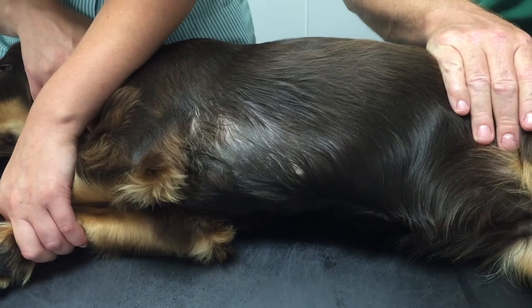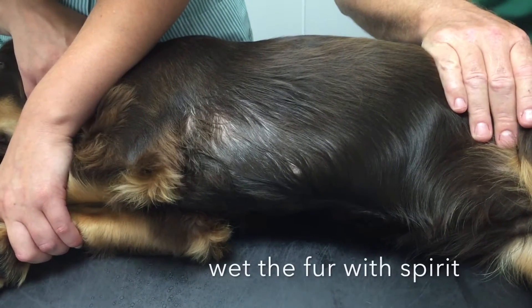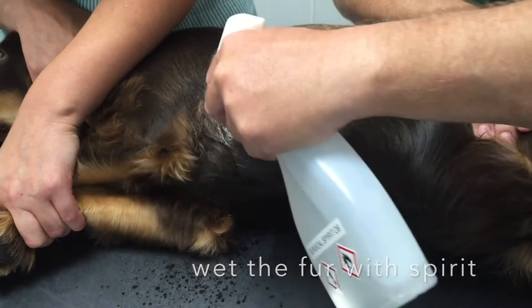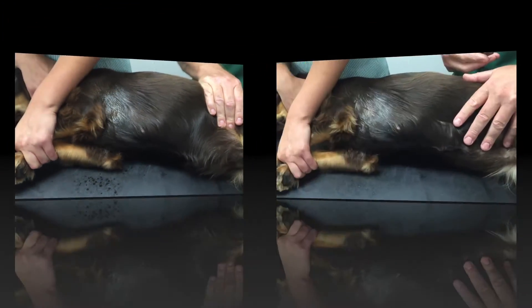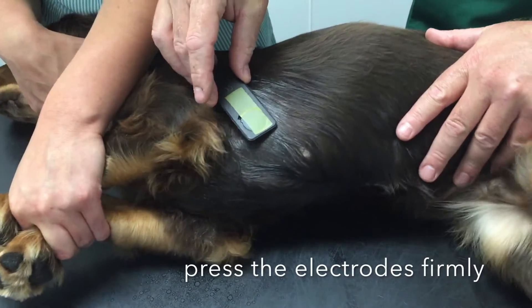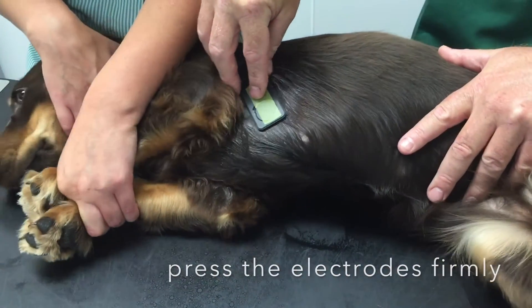Wet the skin over the heart with spirit or alcohol to make contact through the fur. Press the electrodes onto the wet skin, usually at a tilted angle like this.